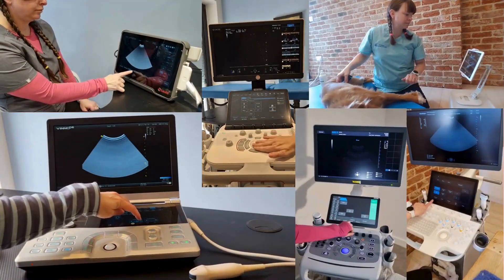Let's see how to find those buttons on your machine. For the focal zone, look for that triangle, arrow, or chevron along the side of your image. Move it using the trackball or find a button labeled 'focal zone' or 'focal position.' If the machine won't let you move it, adjust your depth so your structure lands where the focal zone already is. If it's linked to depth, it's even more important to get your depth correct — only image what you need to image and just beyond.